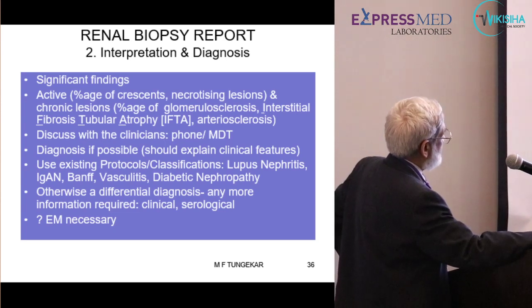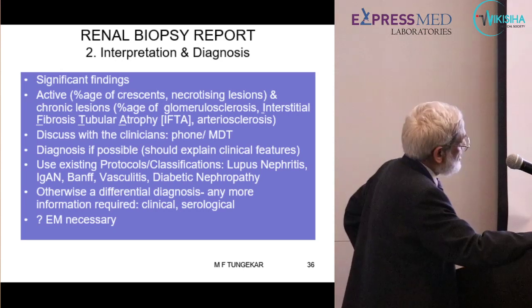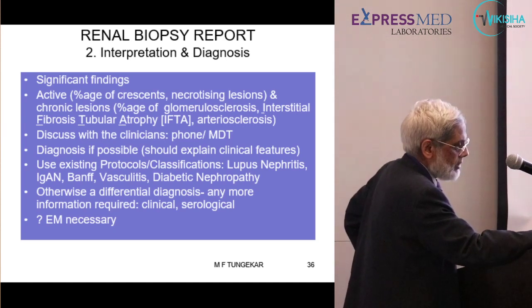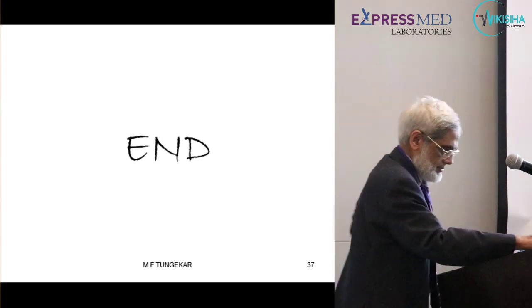If you can't make a diagnosis, offer a differential diagnosis, or if more information is required, you suggest some more serological tests, or if an EM is necessary, point it out in your report, and that's the end of it. Thank you very much.